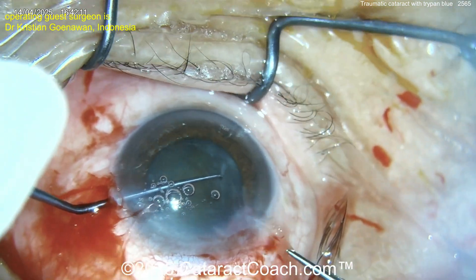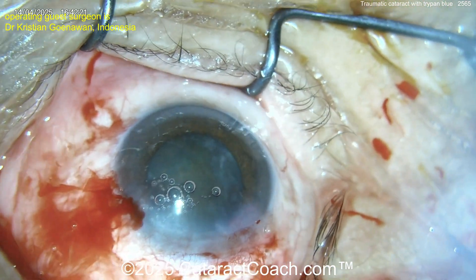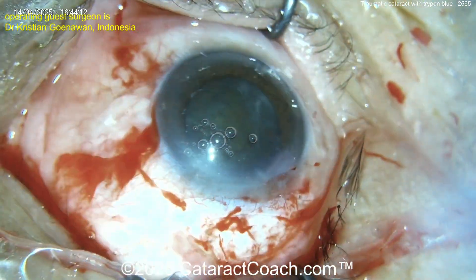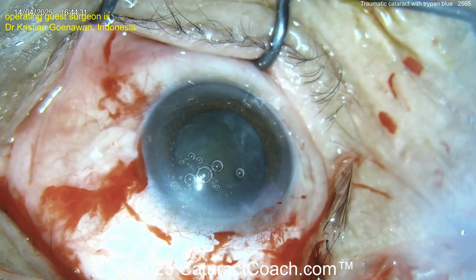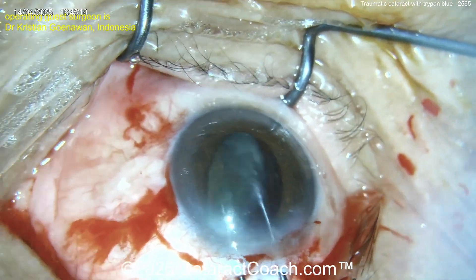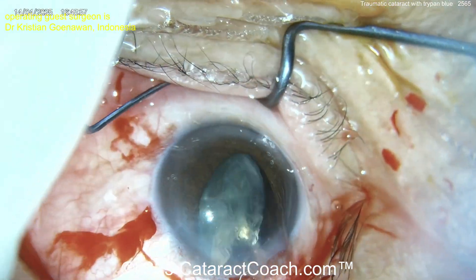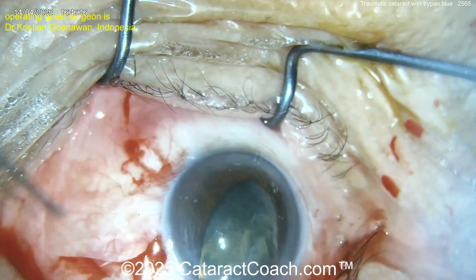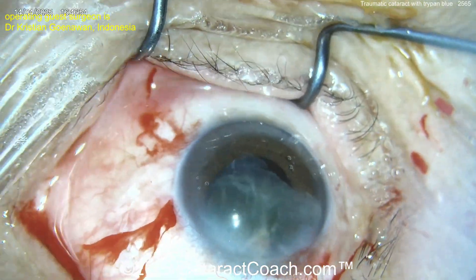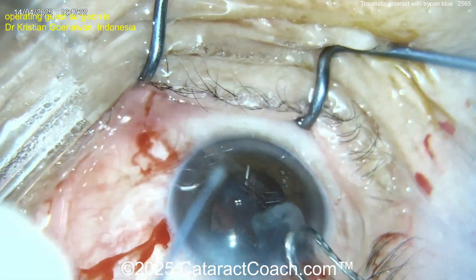Not taking the CTR out — okay, abandoning the CTR, that's fine, I've done that before. Now there's the main incision, so the larger scleral tunnel is going to be done here. If you have extensive zonular loss more than you expected, just grab the whole lens with two instruments and bring it up. There's almost no zonular support. Remember: sometimes if you have a lot of vitreous prolapse, the vitreous is actually holding the cataract in place.